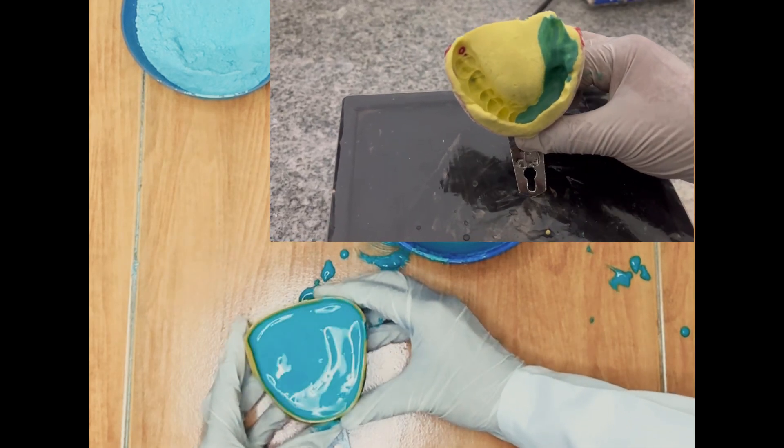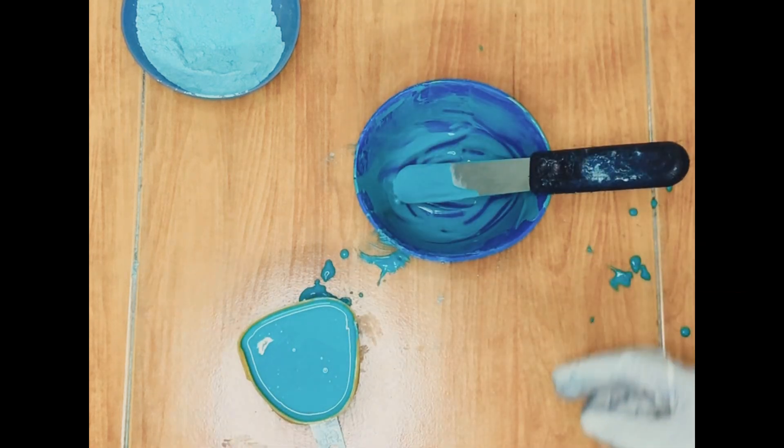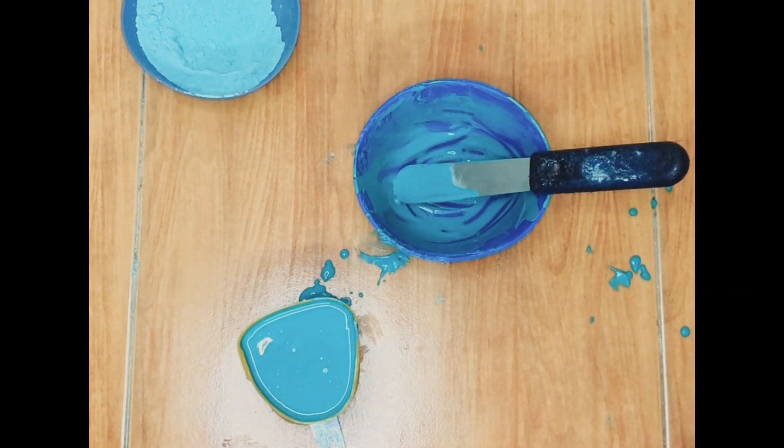Use of a mechanical vibrator allows us to do the same procedure precisely, resulting in a denser cast. The poured impression should be allowed to set completely.